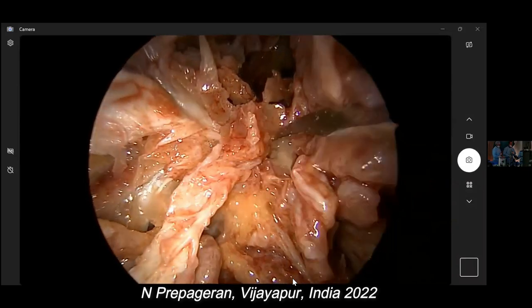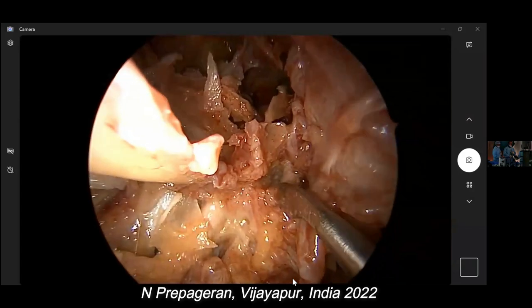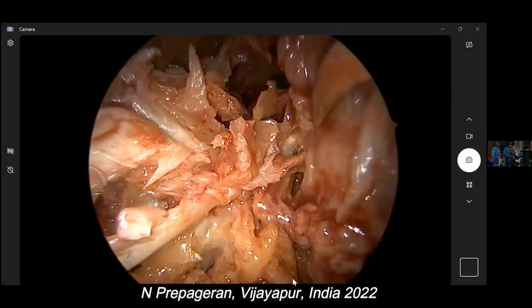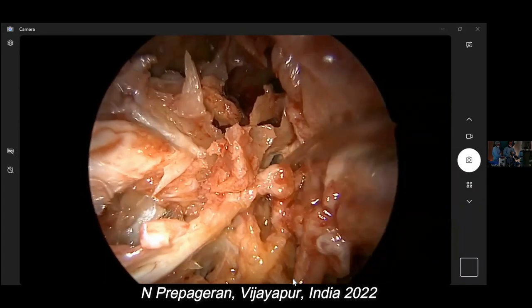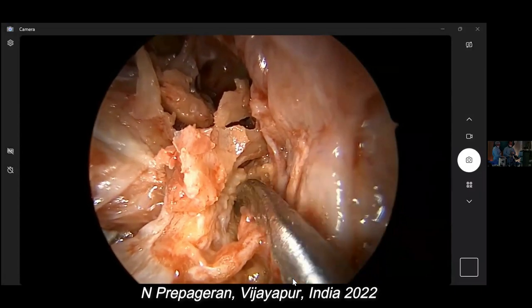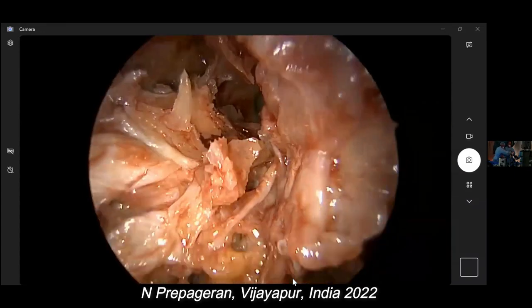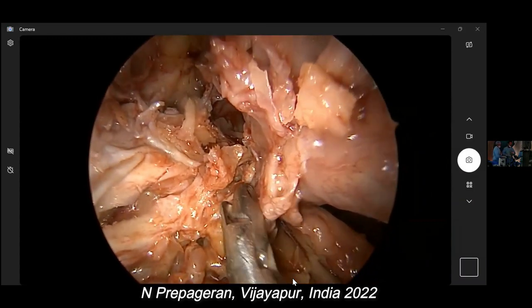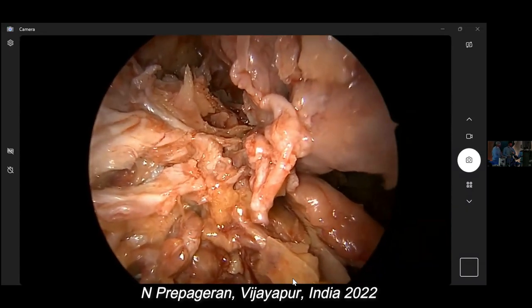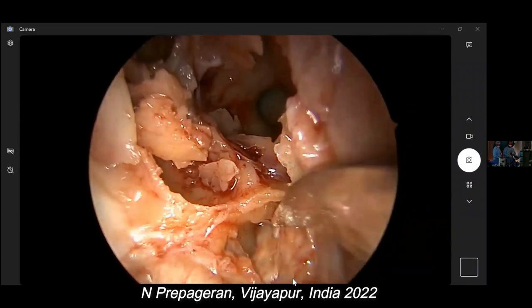Okay? The Vidian nerve is always medial and inferior. That should be somewhere here. This is your pterygopalatine ganglion. Dissect the floor of the sphenoid sinus. And that's your Vidian nerve. Can you see? Can you guys see? So you see the nerve that's coming. I think remove this bone first. Let's remove that bone. So now we did. Can you see, guys? Nicely seen. Vidian nerve.